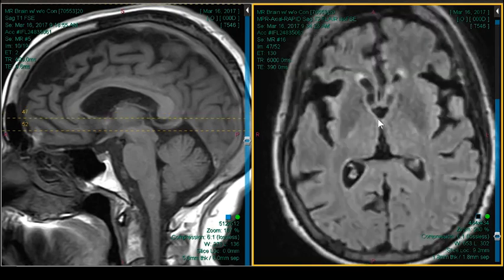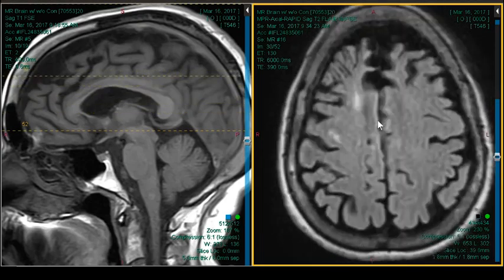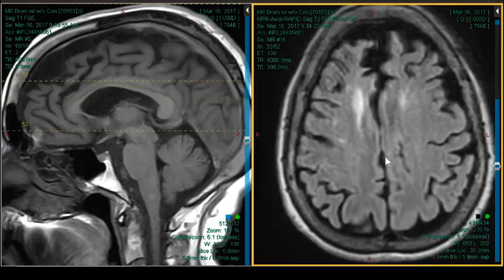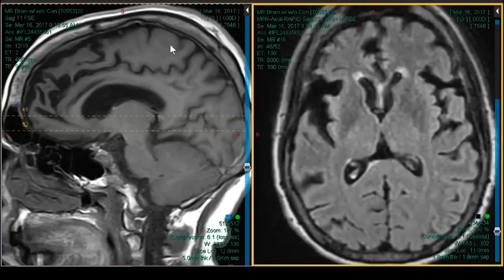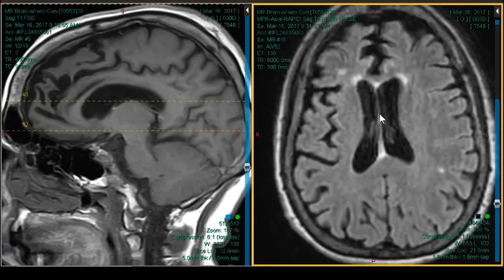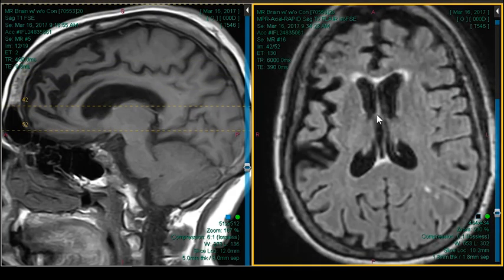So we have a pattern of atrophy, and Alzheimer's is one. We were talking about that. The temporal horns are critical, but also parietal. So this is not a parietal pattern. It's a frontotemporal pattern. So that's going to take us down another track.